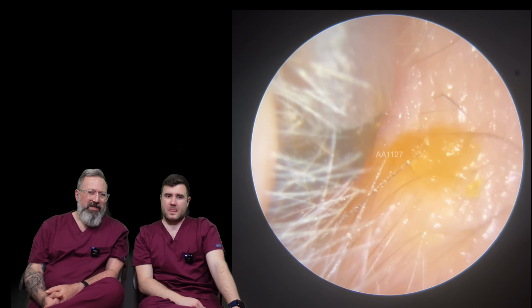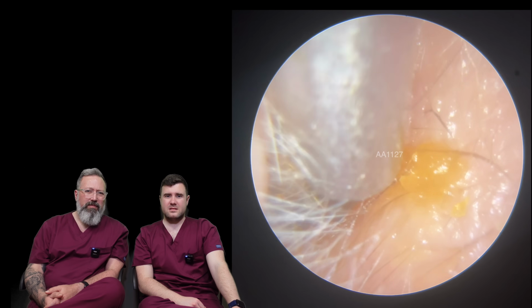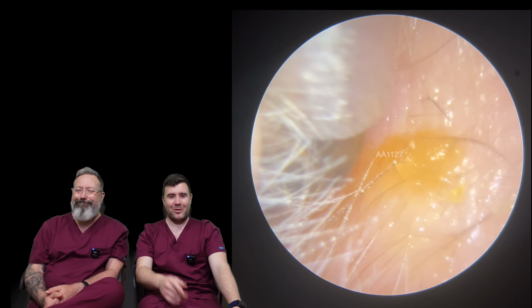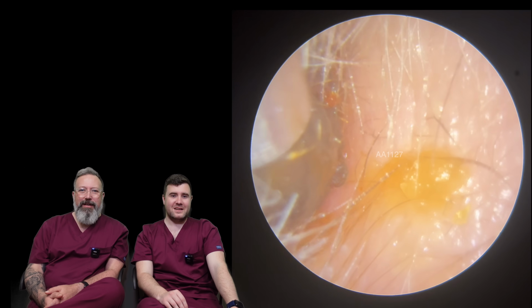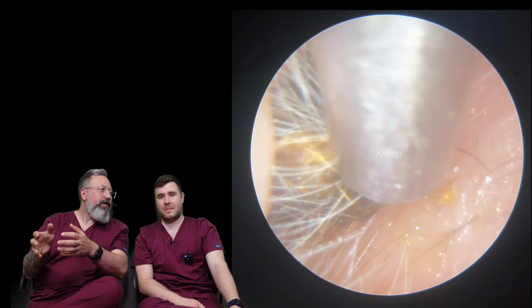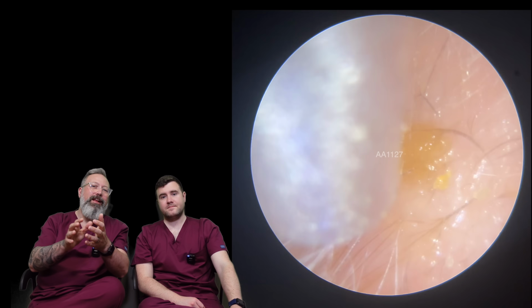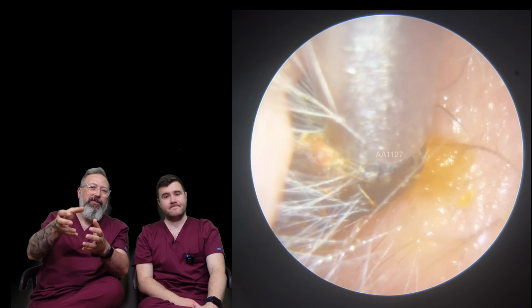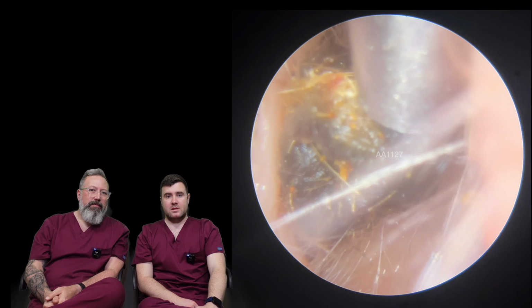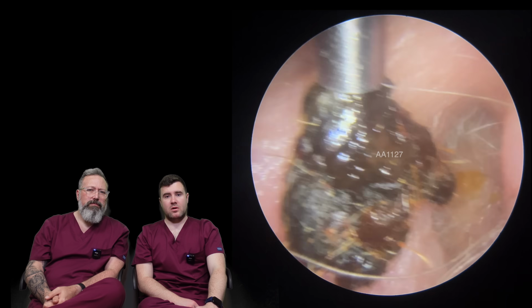This wax was deep as well. That was right down on the drum. Always stuck, and it's always this area that gets stuck. So I'm just going to give it a little bit of a... You can't hold it open, can you? That's the problem. You can't hold the ear canal open when it's narrow. But as you pull this through, it just collapses around the plug. So it's coming out all right so far.